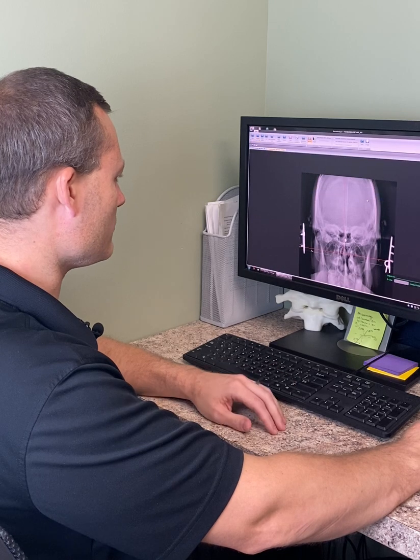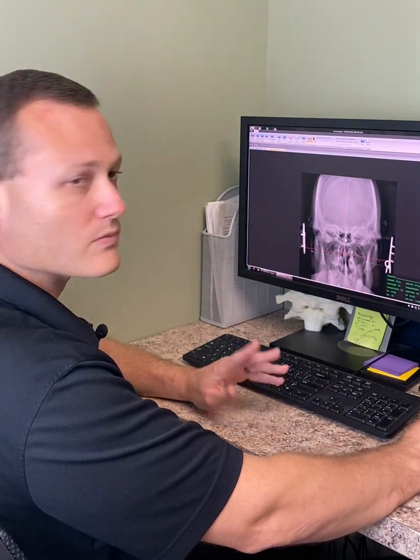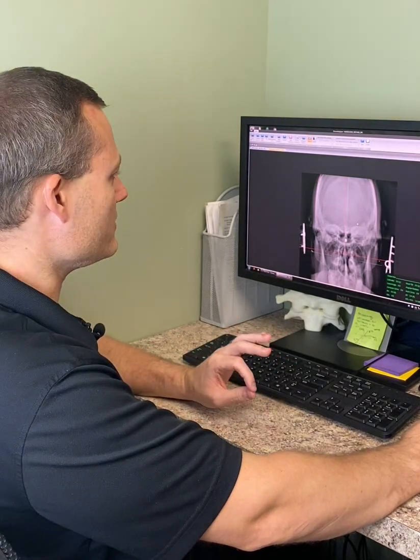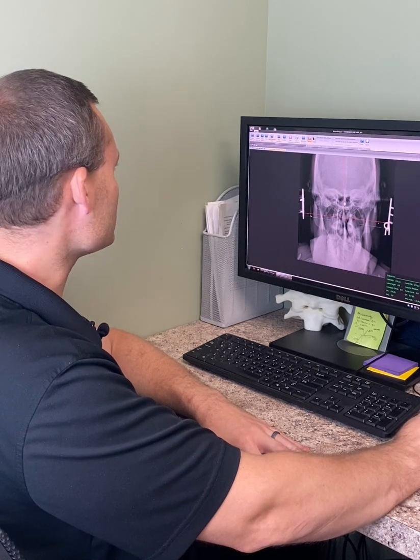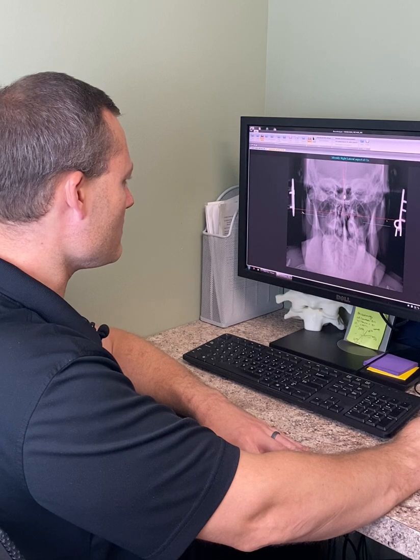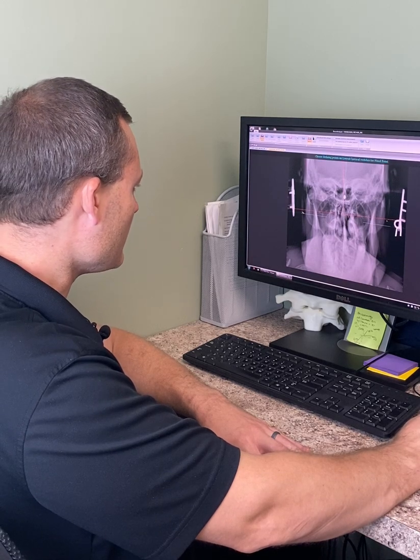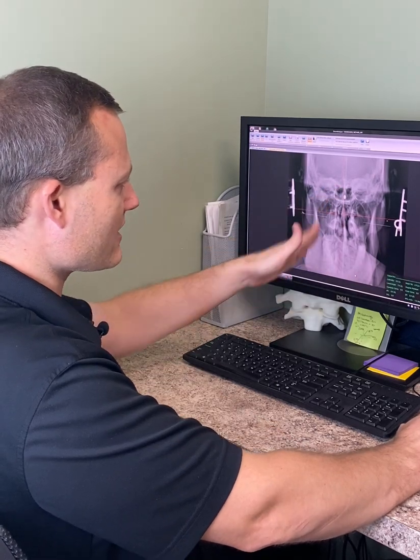We're looking at the skull, how it's shaped right there. And then these numbers come out the bottom. It tells us how to angle our vectors when we do the adjustment. There's certain angles that we have to take to make that adjustment work. And also different ways we put the patient on the headpiece so that way we can make that exact right adjustment too. And the other lens that we put on this film is our lower angle points. And these points right here help us to see how the patient's lower part of their neck relates to that too.